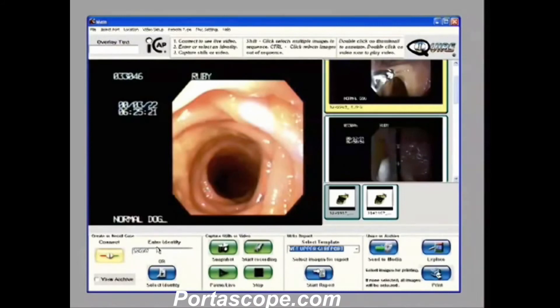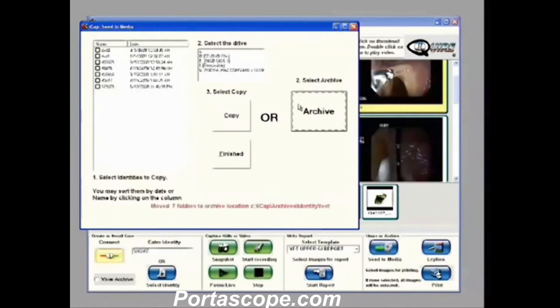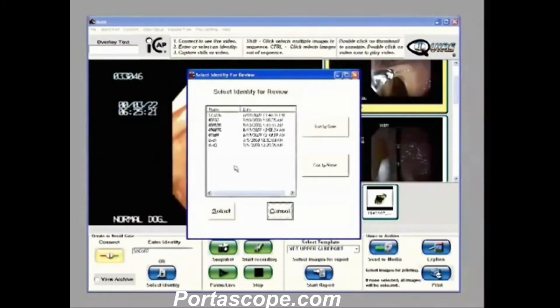Perhaps you do five or six cases in a day and want to go back at the end of the day to do your reports and annotations. When you're finished with these cases you can come into Send to Media, take the ones you want, and hit archive. It takes those cases and moves them to the archive location. So now when I come in here they're archived and off and forgotten until needed later.